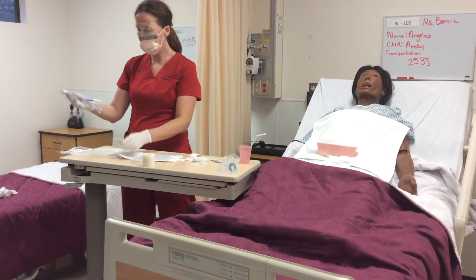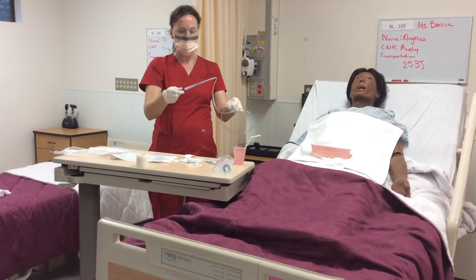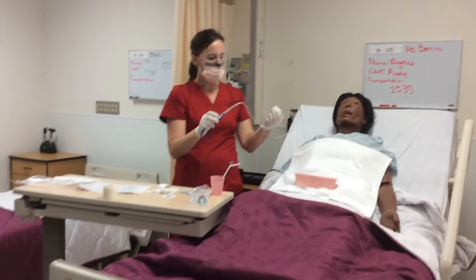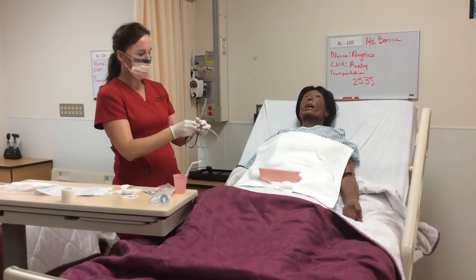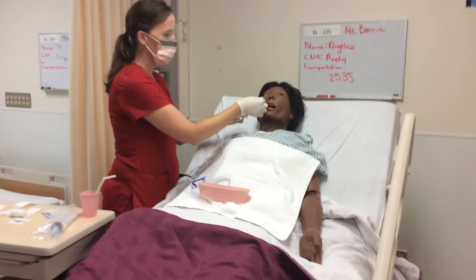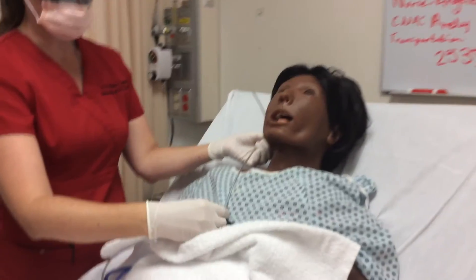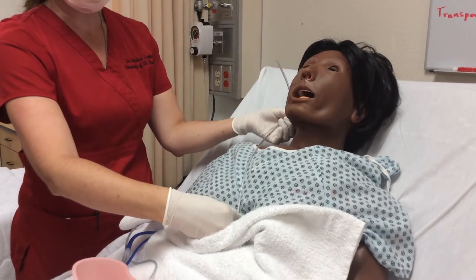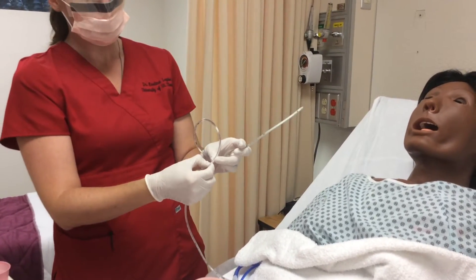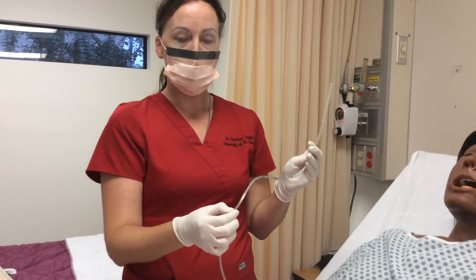Before I lubricate the tubing, I will occlude the exit just in case there are any gastric contents going up the tubing so it will not spill. I will measure using the traditional measuring approach: from the tip of the catheter to the tip of the nose, to the ear lobe, and down to the xiphoid process of the patient. This xiphoid process measures about 50 cm.